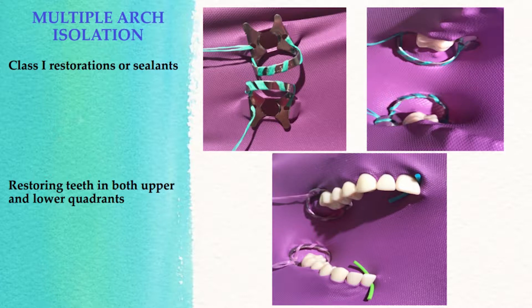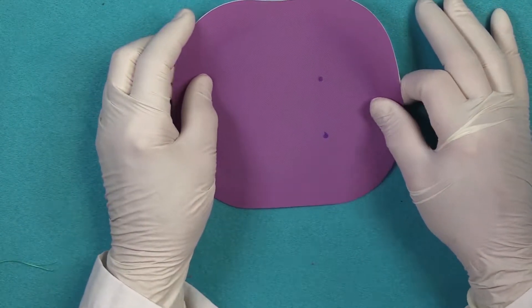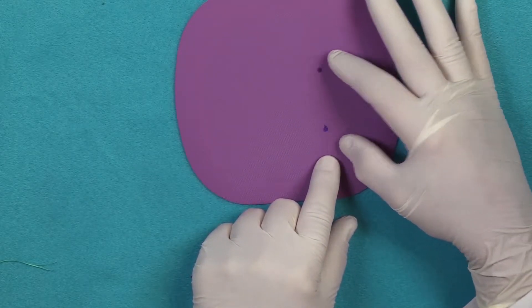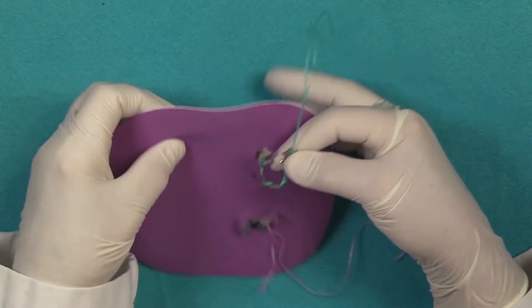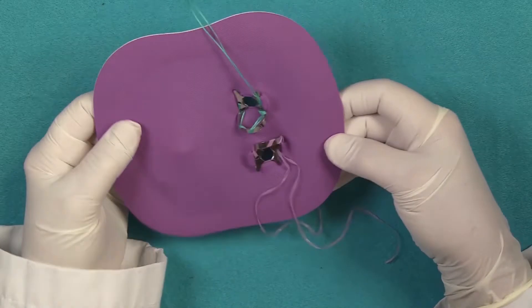The important thing is to prepare your dam so that you're leaving enough space between your anchor teeth. In this case we're using the non-latex frame flex-a-dam, which has the integrated frame — much easier to deal with. We're isolating the first permanent molars on the upper and lower arch, and I've made sure there's enough room between these two regions. Once the length and separation between the clamps is determined, we're ready to place our wing clamps into position. We simply insert the wing clamp into the dental dam, and for the upper arch the clamp is opposing in this manner — so your isolation will look like this before you go to the mouth.